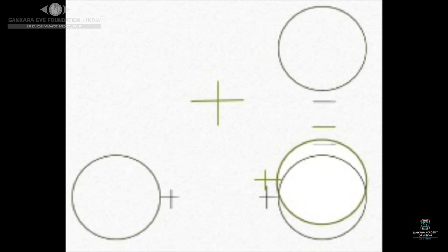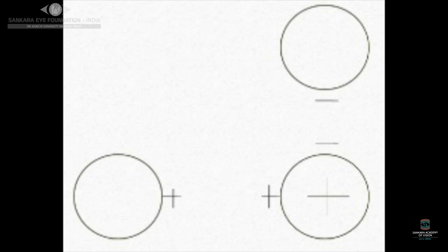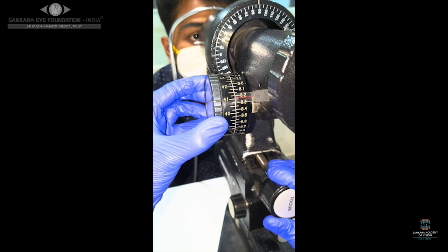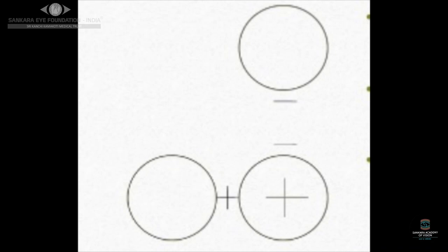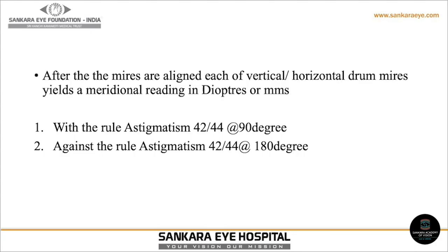During focusing, the most crucial step is to focus the mires and adjust the instrument so that the plus sign is centered on the lower right-hand circle. After centration of the plus sign, adjust the horizontal power wheel until the horizontal mires are in the locked-up position. Once the horizontal mires are locked, adjust the vertical drum until the vertical mires are also locked, achieving superimposition of plus-plus and minus-minus signs, making all three mires aligned. Each of the vertical and horizontal drum mires yields a meridional reading in diopters. With-the-rule astigmatism means the vertical meridian dioptric power is more than the horizontal at 90 degrees; against-the-rule astigmatism is when the horizontal dioptric power is more than the vertical at 180 degrees.